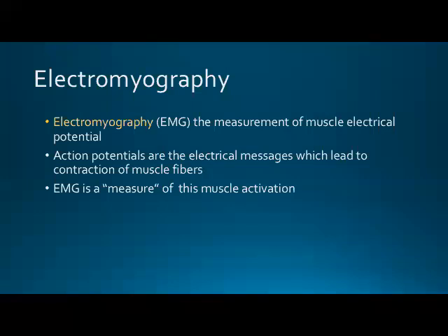So we're going to do some review about what action potentials are and voltage and ligand-gated channels in our next lecture. But just keep this in mind as you're learning about EMG, that that's what it's looking at. It's looking at action potentials moving down the muscle fiber itself or muscle fibers as a bundle and taking that electrical activity, giving us then a screen interpretation of that activity that we can then analyze and try to get some inferences on what's going on within the working muscle, which is pretty cool.